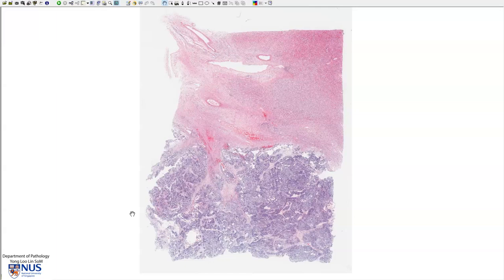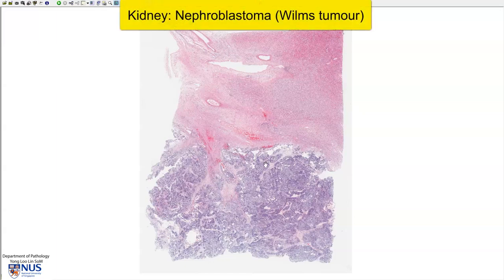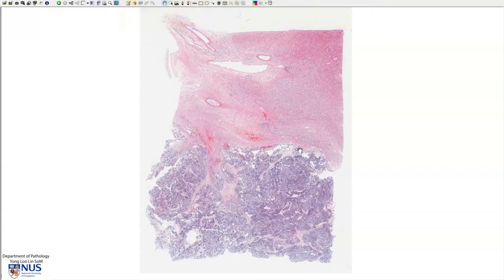This is a virtual microscopy slide of a case of nephroblastoma of the kidney, also known as Wilms tumor. It is a malignant tumor of the kidney that usually occurs in the pediatric age group, for example three to four years old. The overall prognosis of this tumor is good. Before we look at the tumor, which occupies this bluish area, let's have a very quick recap of the normal kidney histology.